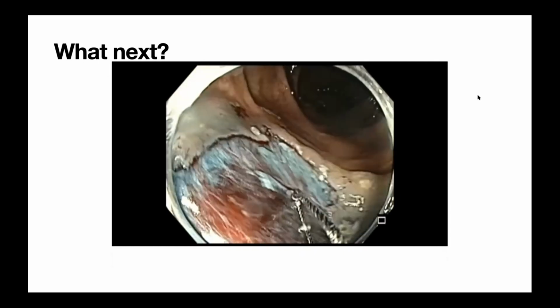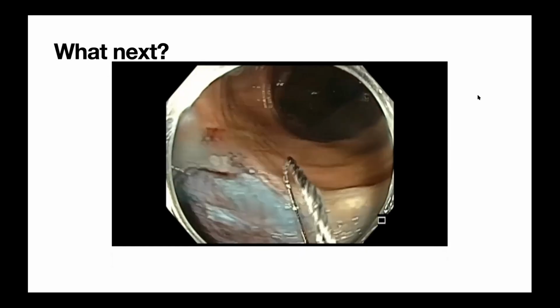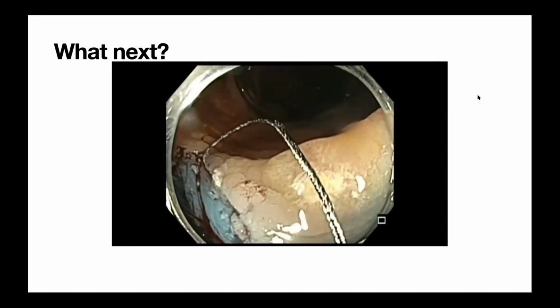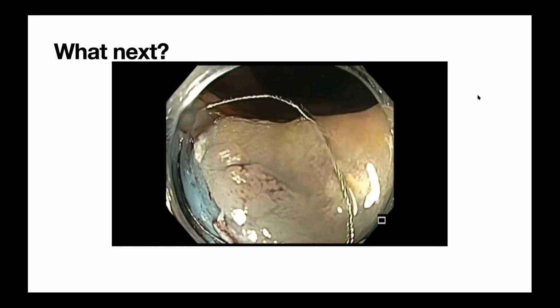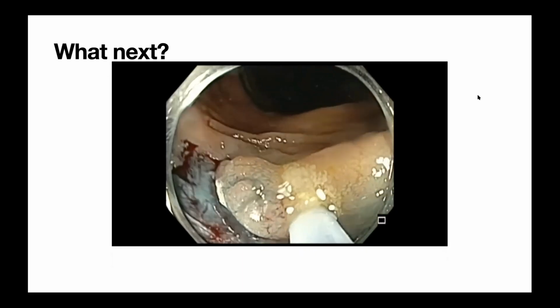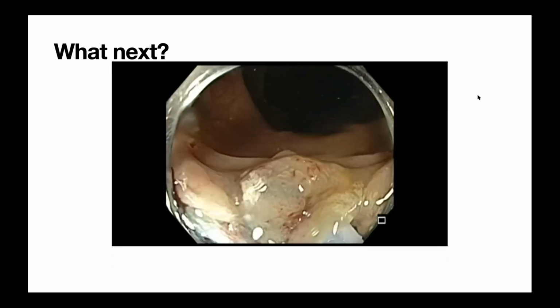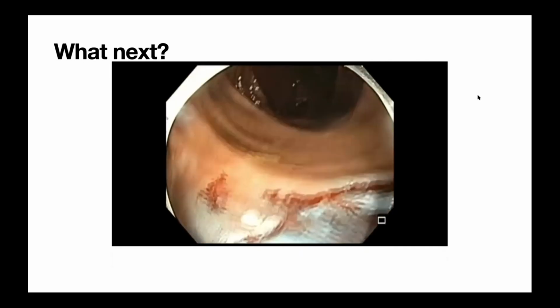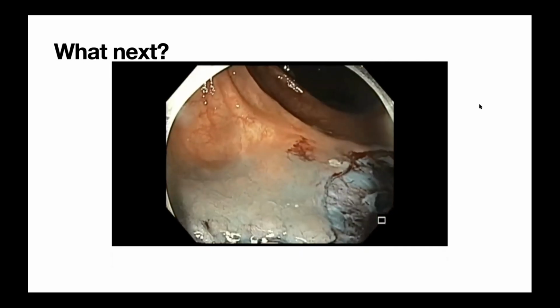Sriram, any comments? Roy? Yeah, beautiful case, sir. I send the materials to the participants on the image enhanced endoscopy of IEE, of SSA. Okay.